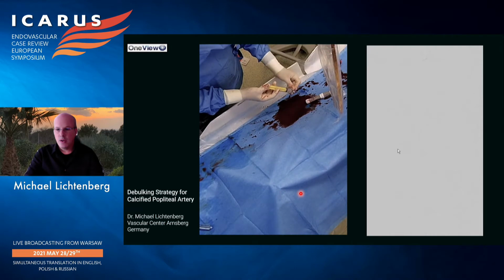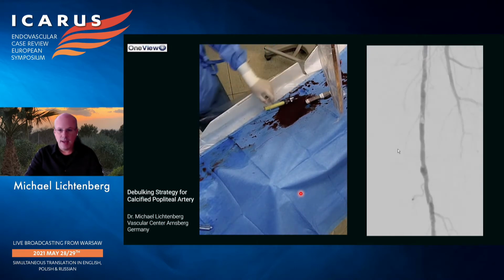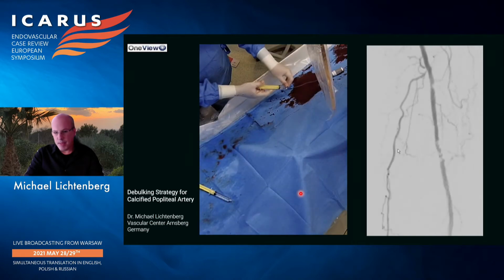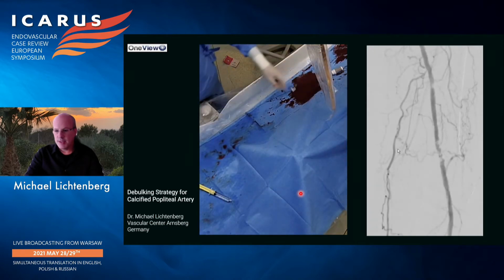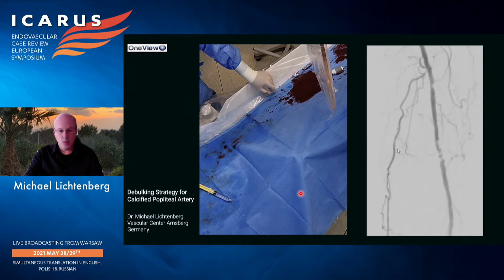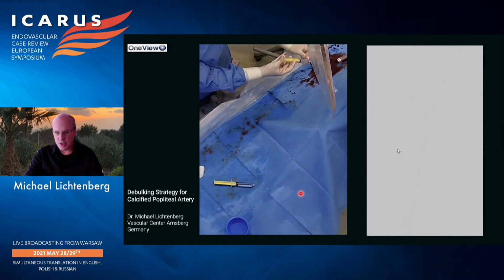And you could see here a long lesion situation, a calcified lesion in the SFA, predominantly in the middle and in the distal part. The main issue here is in the popliteal segment 1, 2. So a very important area where we definitely want to prevent stent implantation.